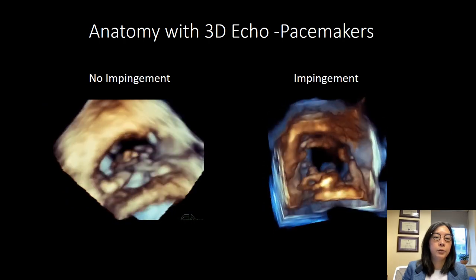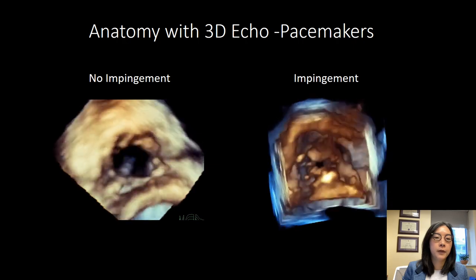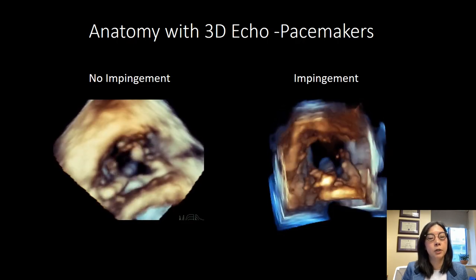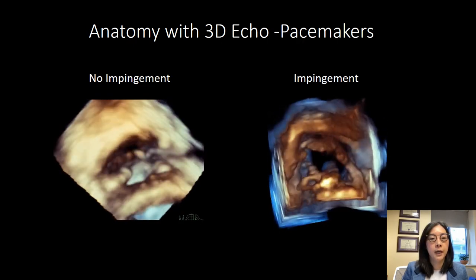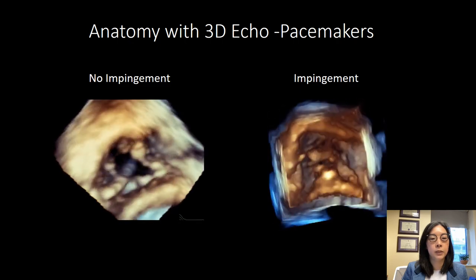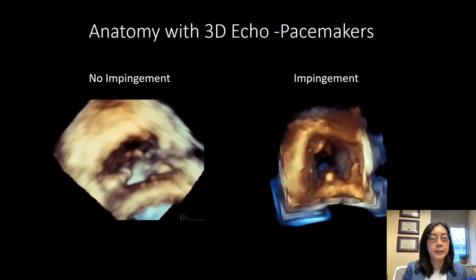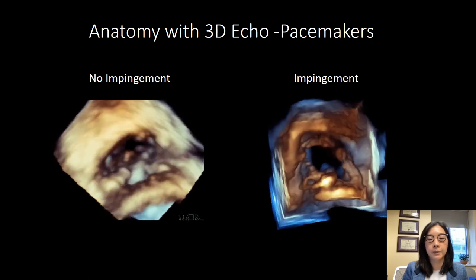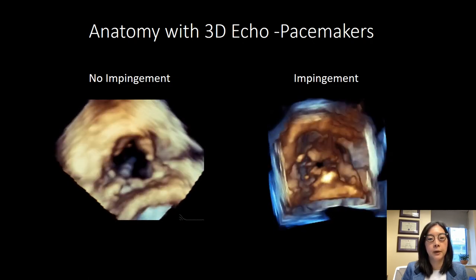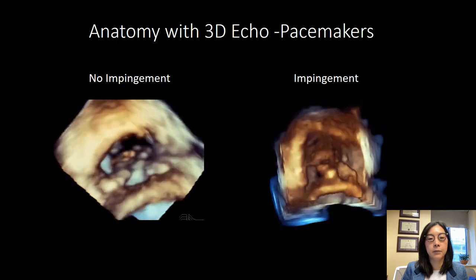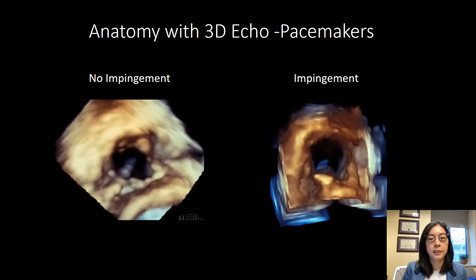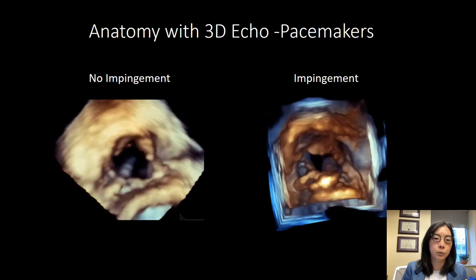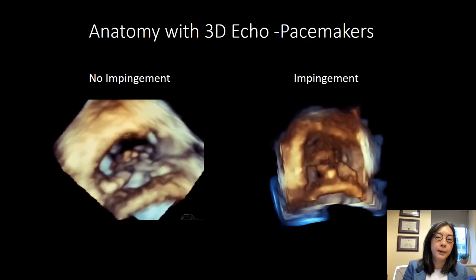One of the most valuable uses of 3D echocardiography has been identifying the role of pacemakers in the development of tricuspid regurgitation. In the image on the left, viewed from the right ventricle looking up at the valve, the pacemaker lead is going between the septal and the posterior leaflets in the commissure — it's not affecting coaptation and the leaflets come together with no gap seen during systole. In the image on the right, the pacemaker lead is impinging on the septal leaflet, and during systole there's a gap between the anterior and posterior leaflet and the septal leaflet, because the septal leaflet is unable to move forward to coapt with the anterior and posterior leaflets.